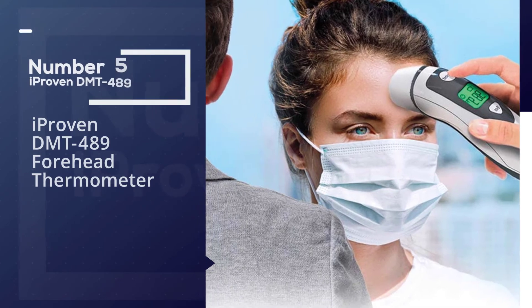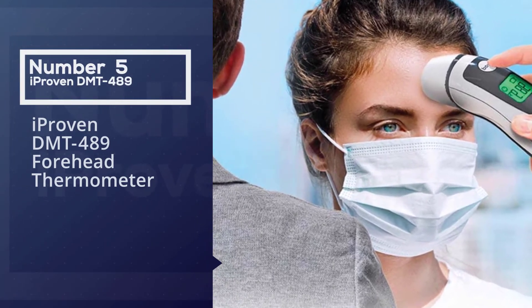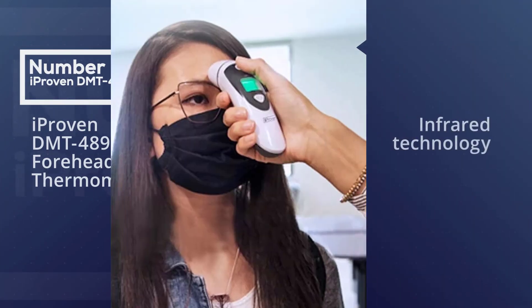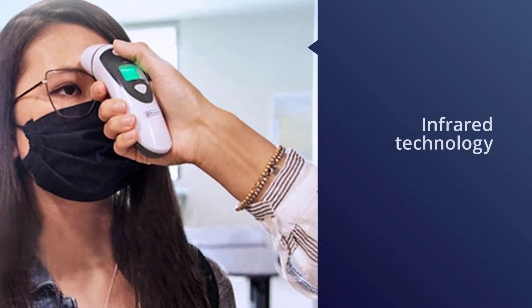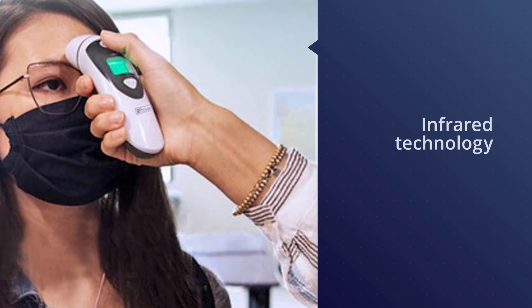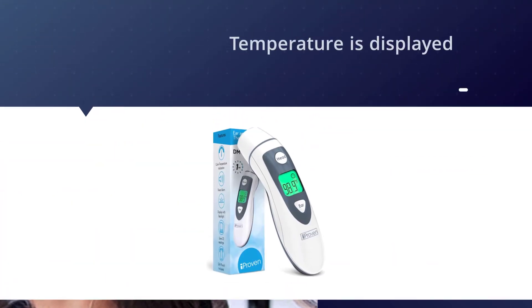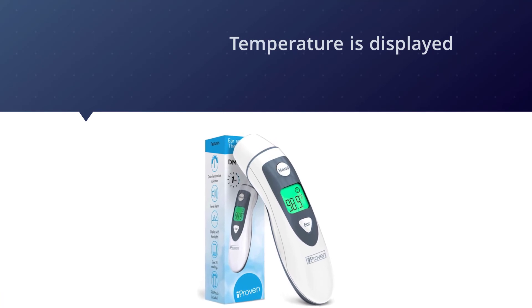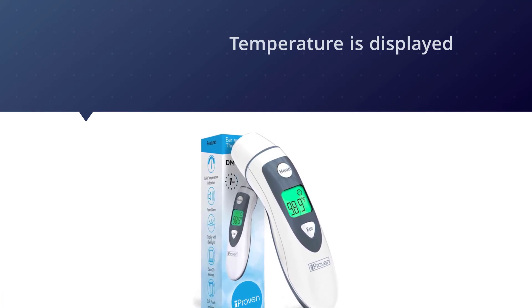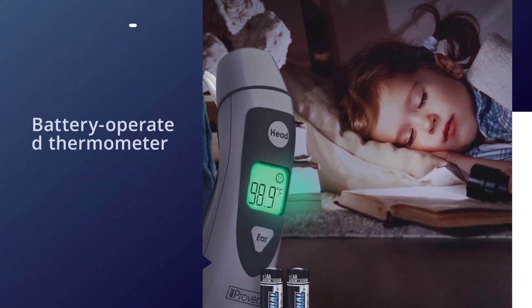Number five: the iProven DMT-489 forehead thermometer. Squirming kids are no match for this digital thermometer, which uses infrared technology to measure body temperature from the forehead or ears for a more exact reading in just one second. A quick beep plays when the temperature is displayed, and it flashes either green or red to indicate a fever.